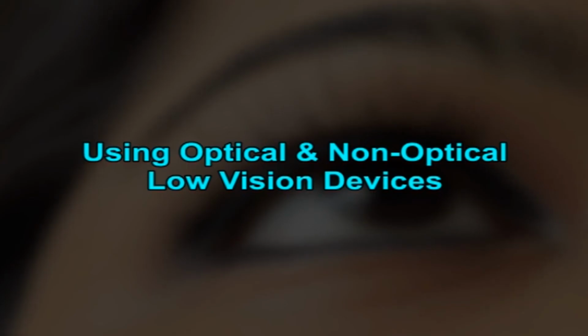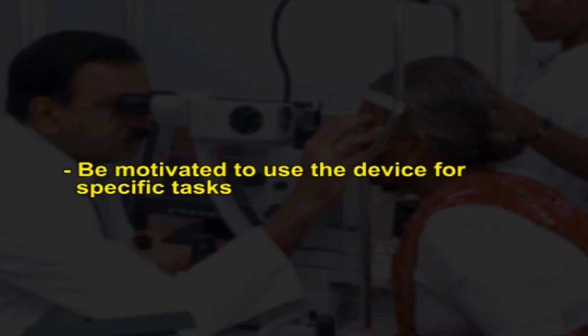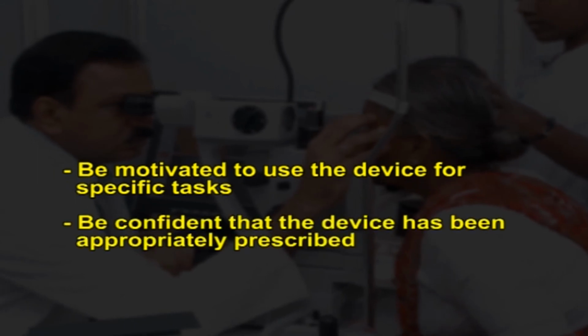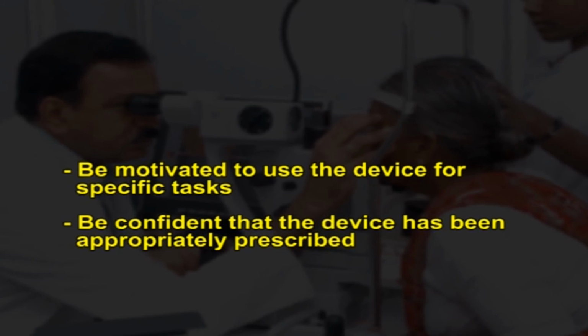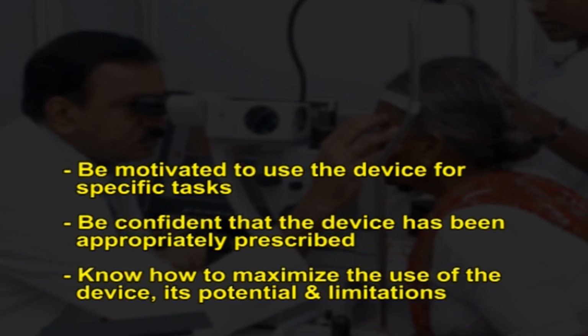Using optical and non-optical low vision devices. Before any optical or non-optical device can be effective and comfortable, the low vision person will need to be motivated to use the device for specific tasks, be confident that the device has been appropriately prescribed, and know how to maximize the use of the device, its potential and limitations.